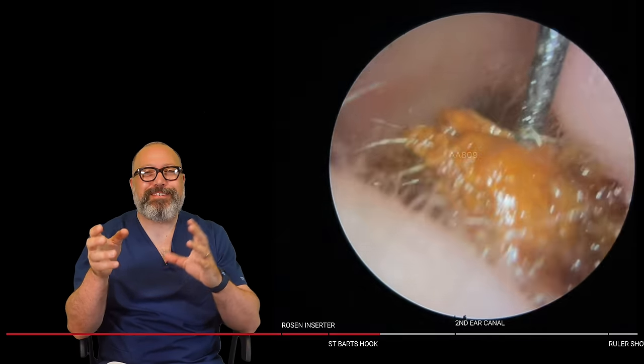And the next section, let's give this a little bit of a wiggle as well. It is just pulling all of these sections away here. We've still got those layers running through this. Bit more. There we go. Out that piece comes. Right. That's a good size piece. That's what you want to see, is pieces that size coming out. I can just see a glimpse of the eardrum beyond there.